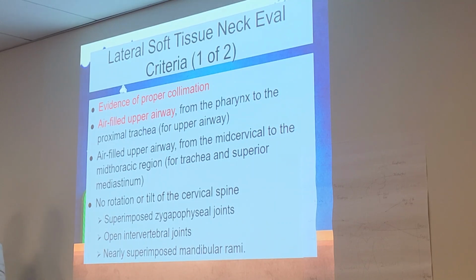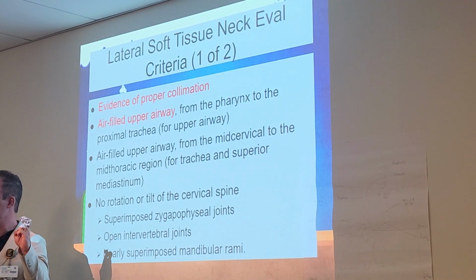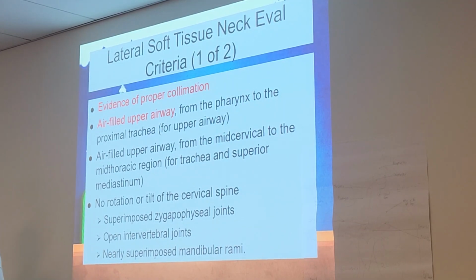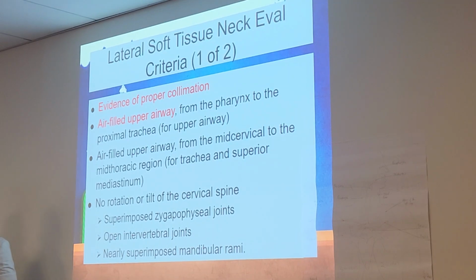And remember, when we say something's lateral, we're also saying it is in profile. So the air-filled trachea is in profile on this lateral view. A lot of times when we're referring to the stars of our show, we're saying that particular anatomy is in profile, depending on the view we're talking about, of course. If you think about a profile, what's another way we use the word profile? Looking at someone from the side, profile view. That's something to help you remember.